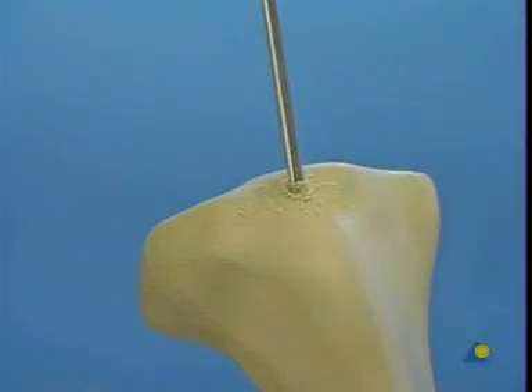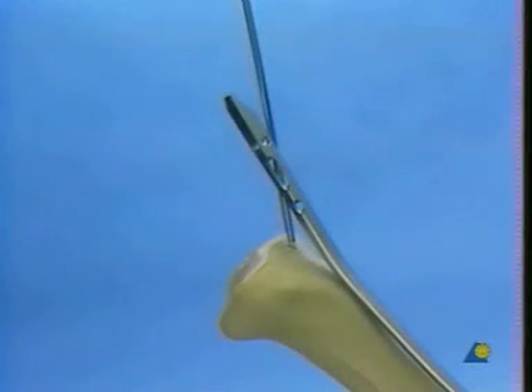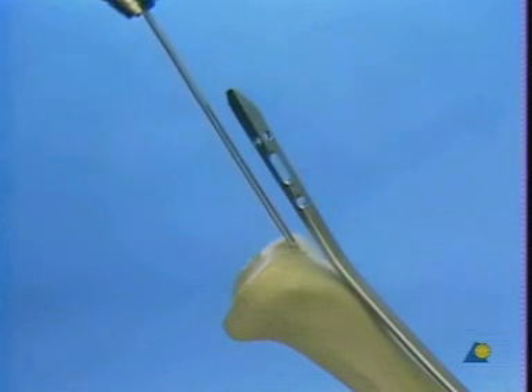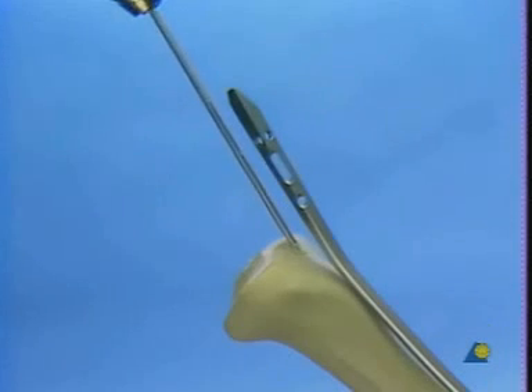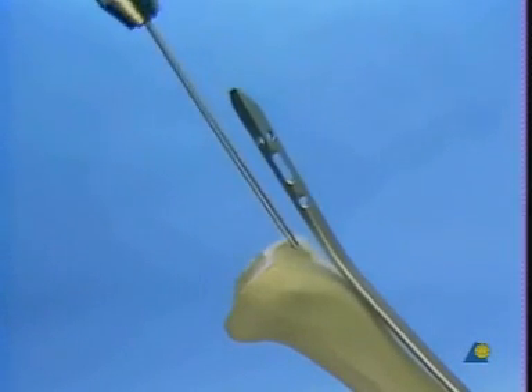The exact orientation of the insertion canal is important. To assist aiming, a nail is laid along the anterior edge of the tibia. The guide pin must be tilted in a dorsal direction until it lies parallel to the proximal part of the nail. Once this is done, the guide pin can be turned until it enters the medullary canal.